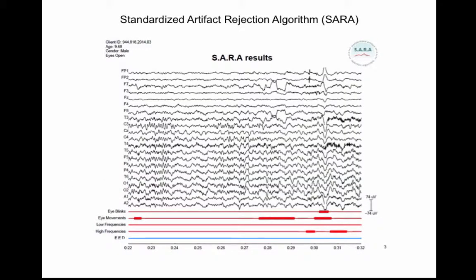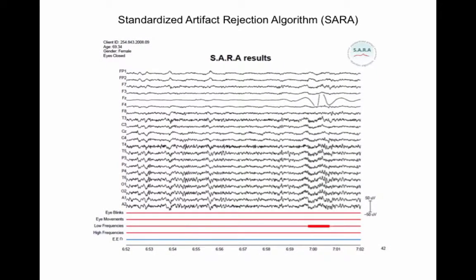The next example shows a segment of EEG that contains both eye blinks, eye movements, and high-frequency artifacts, present in different channels. Here, a low-frequency artifact is detected at FZ.